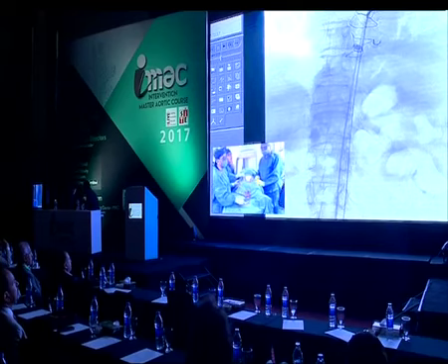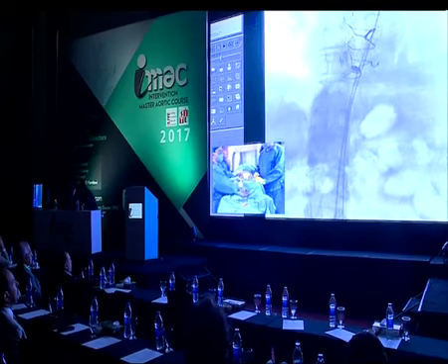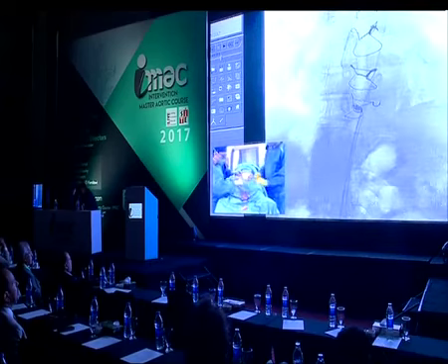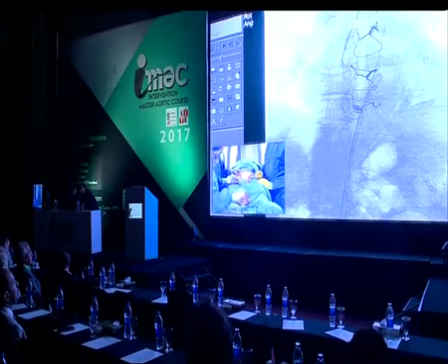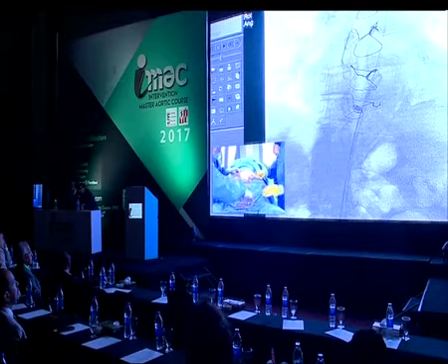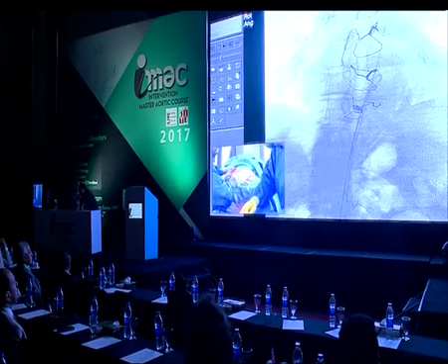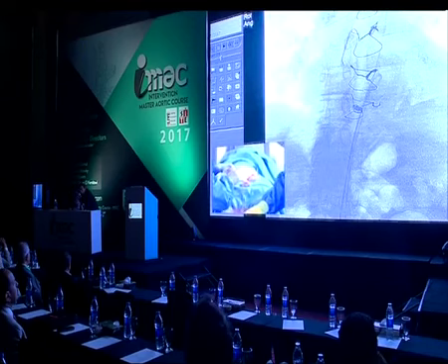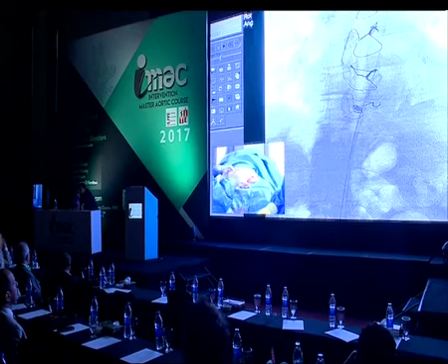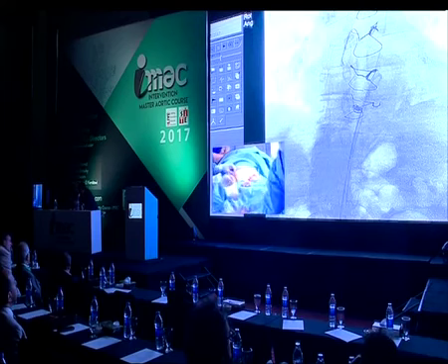150. Okay. So it's 34, 30, 150. Does anybody expect any incidence of spinal cord ischemia with a 15 centimeter graft coverage? Yeah, that's a question to the audience. Yes, the question is for the audience now. Does anybody expect after a 15 centimeter graft any incidence of spinal ischemia?